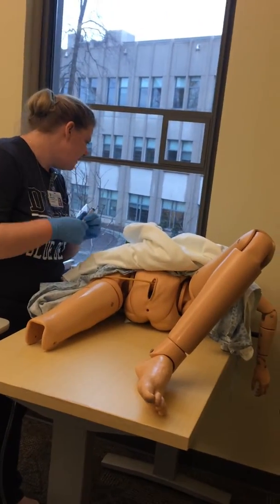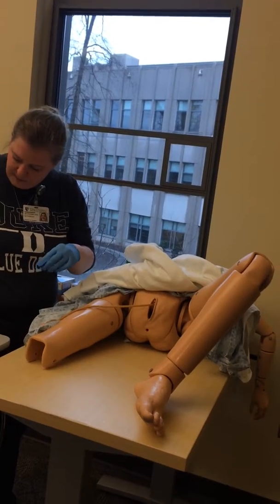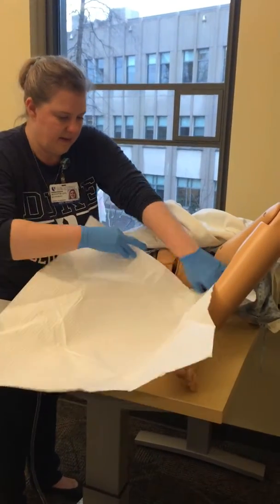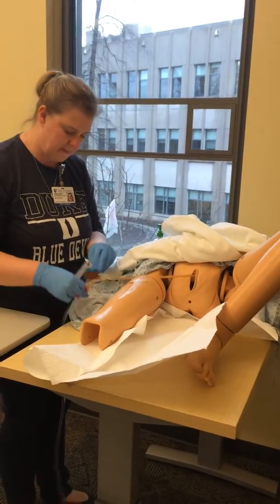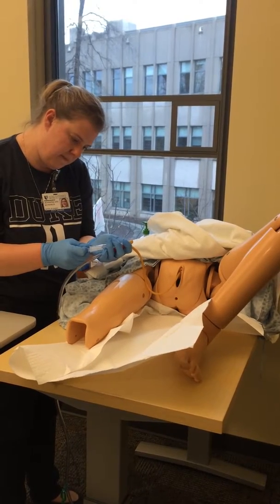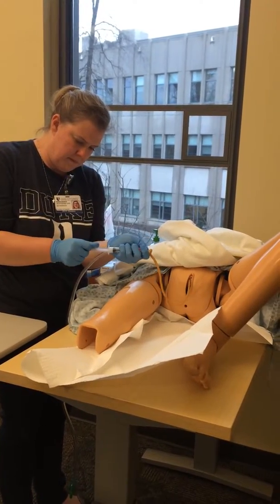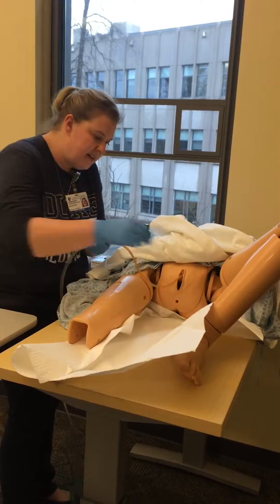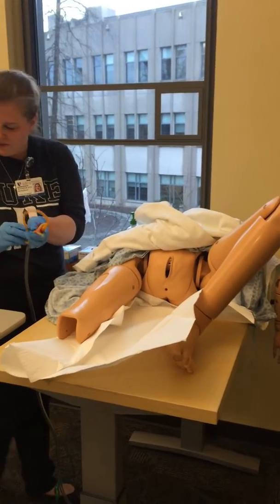Next, we're going to deflate your balloon. First, I'm going to put this pad down just in case something leaks. So let's put this chuck under you first. Now I'm going to deflate the balloon for you. Now I'm just going to slide it out — let me know if you have any pain or anything. All right, good job. We'll dispose of this.